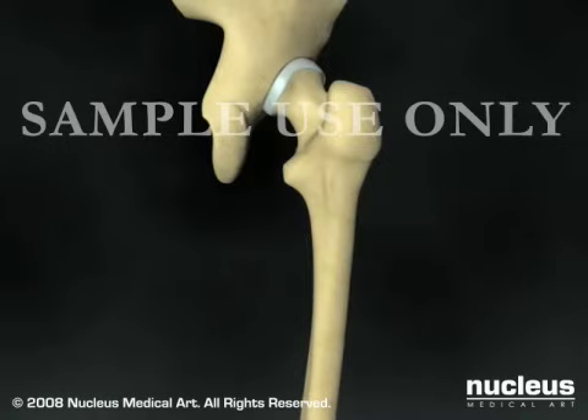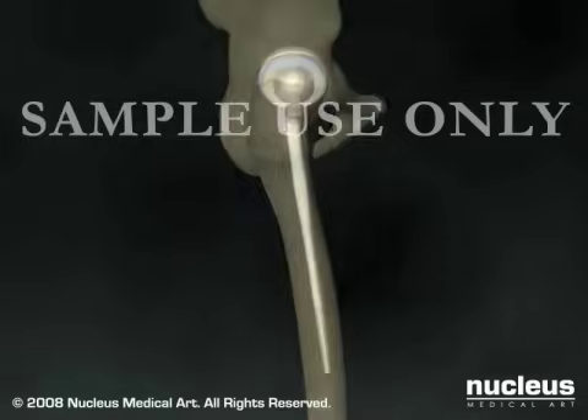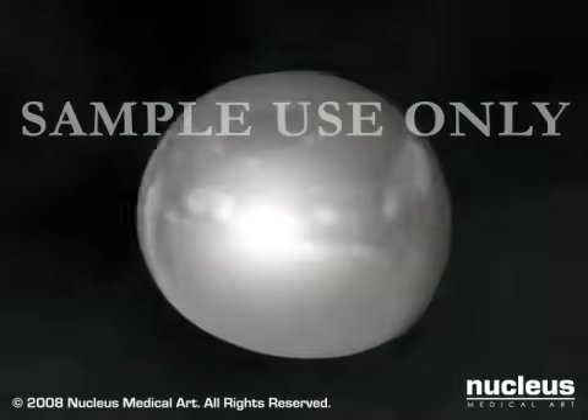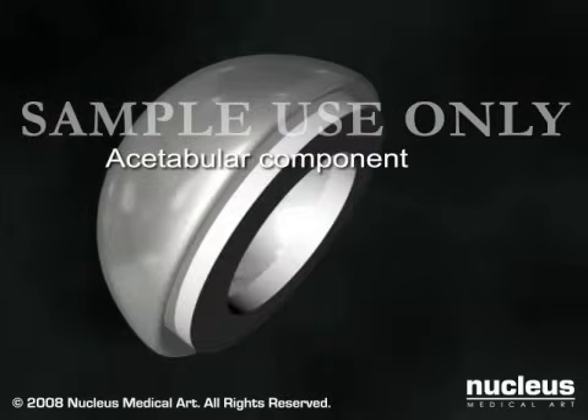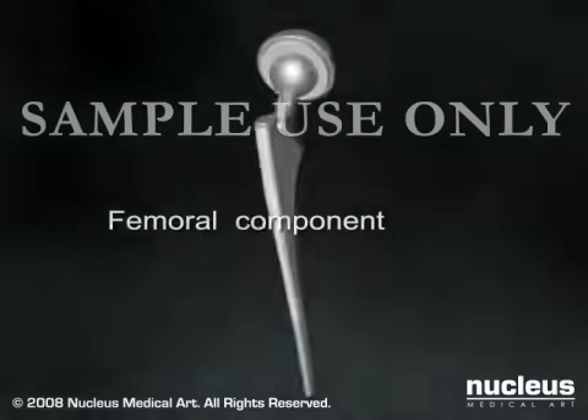During the procedure, the femoral head and acetabulum are replaced with artificial components called prostheses. An artificial hip prosthesis consists of a cup called the acetabular component and a metal stem called the femoral component.